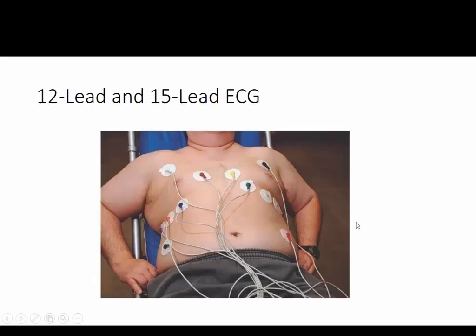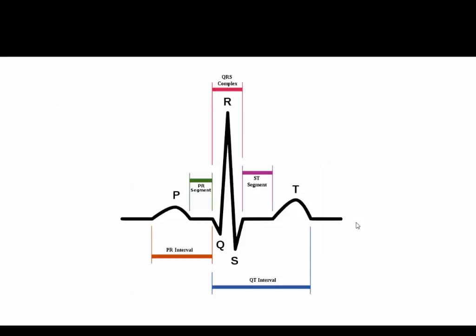Some people that are in for heart attack or having unusual symptoms will have a 12-lead or 15-lead EKG, and that's much more detailed. That's given by a specialist who knows how to apply those patches and where to apply those patches. But we really look for specific functions within the heart with the 12 and 15 lead. So that's much more detailed.